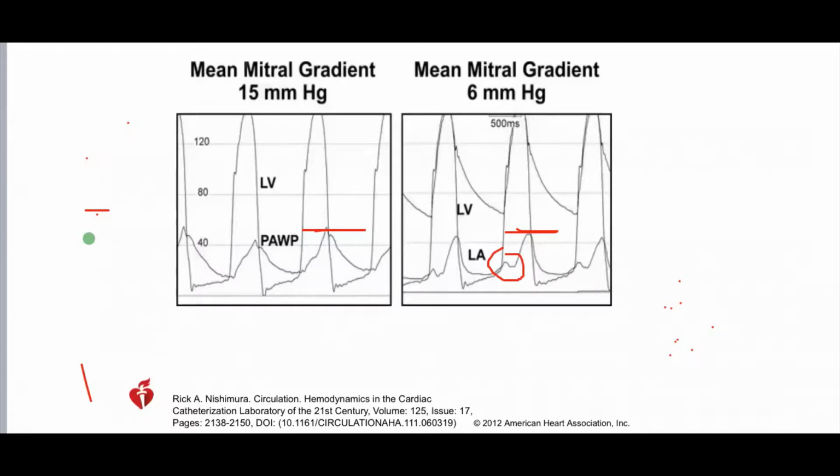V means systolic wave. The systolic wave should follow the LV and go down with the LV, like here. But follow this V wave. It is late, because the wedge is late. And that's why there is a false sense of having a gradient here, which is not the actual gradient. It's just created erroneously because of this visual illusion.